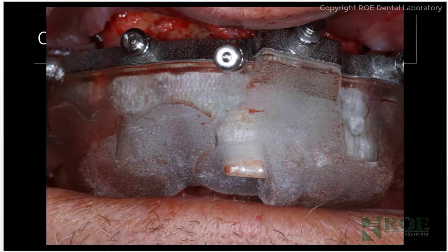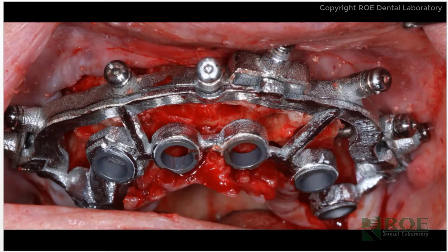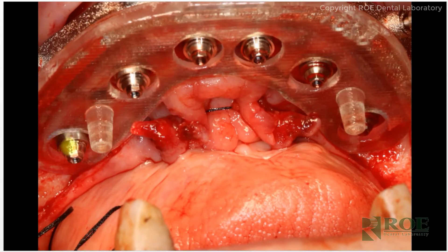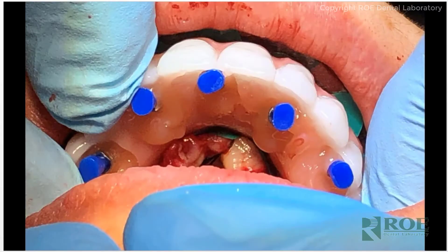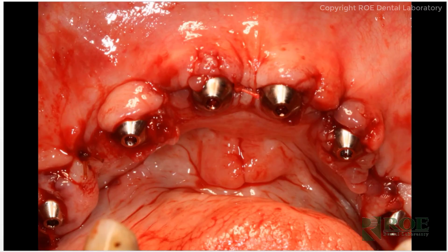The usual routine: the pin guide delivers the fixation base, which stays in the mouth during the entire surgery. The bone is reduced down to the level of the fixation base, usually with some ramping in the posterior. The osteotomy guide is placed, seated, and all the sites are drilled and the implants are placed. Then the multi-unit abutments are seated using the carrier guide, which holds onto and delivers the prosthetic. The doctor inserted all of the temporary cylinders and then louted the prosthetic to each of the temporary cylinders and removed it.